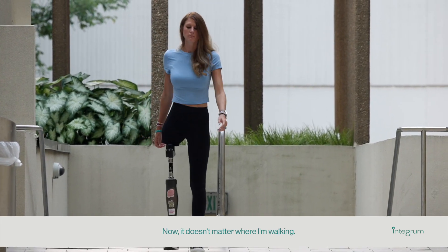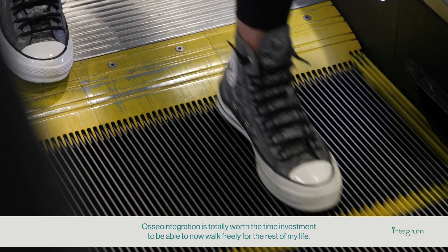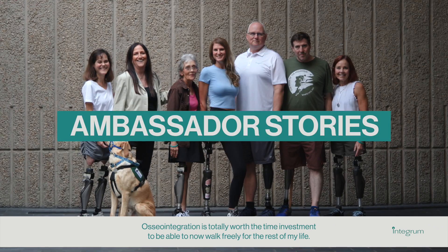Now, it doesn't matter where I'm walking. Osseointegration is totally worth the time investment to be able to now walk freely for the rest of my life.